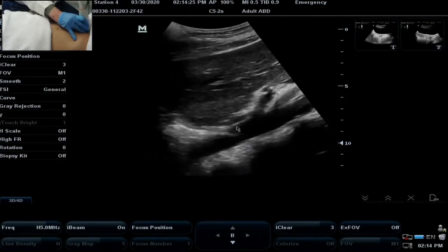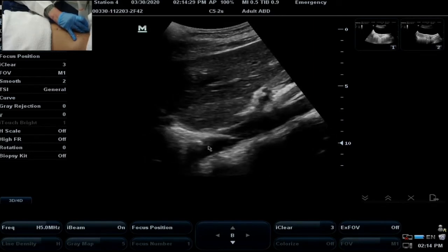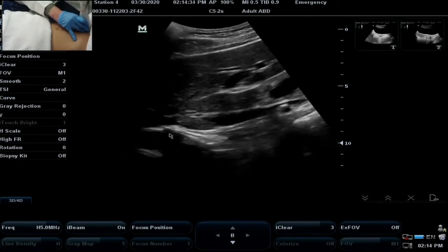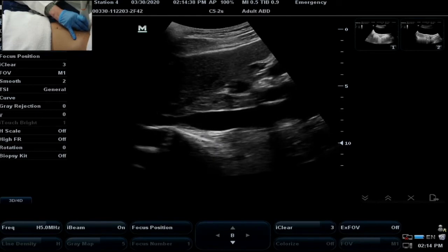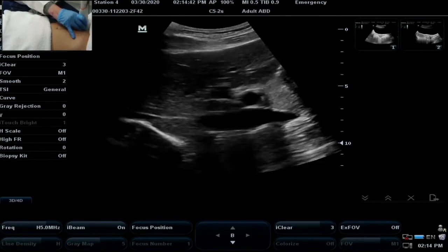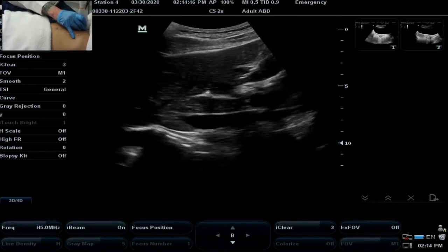Additionally, the aorta sits posterior to the diaphragm, quite deep in the body proximally, but the IVC pierces the diaphragm, and you can see a little bit of diaphragm always deep to the IVC. So always pay attention to your landmarks and your vasculature.